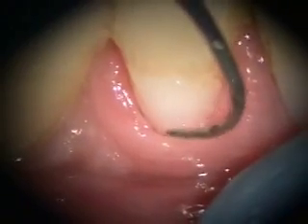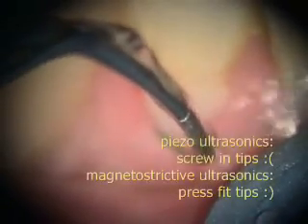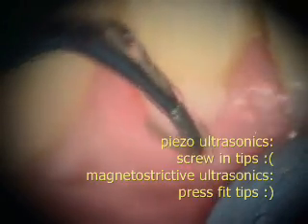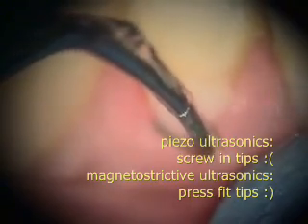We're using this super-fine piezo diamond made by the Satelec company, but we've modified it and made it magnetostrictive. With piezo you have to screw it in and out, but with this I've just used two different instruments and changed it in a matter of seconds — just pop it in and out.